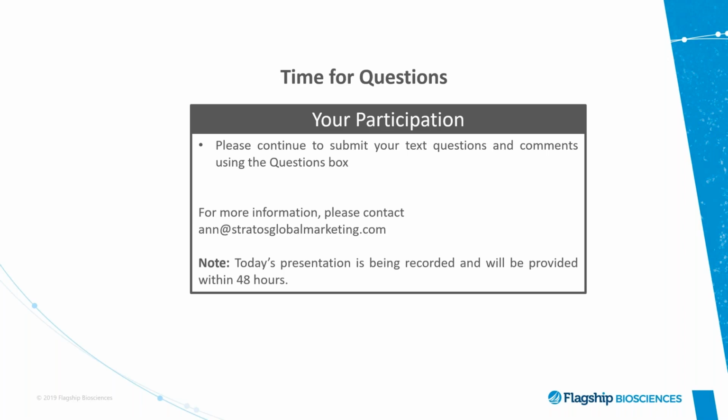Thank you. Another question came up. Does this work for all the PD1, PDL1 assays? And have we had a chance to compare them? Yeah, this actually does work for any PD1, PDL1 assay that has a defined scoring paradigm associated with it. Or for that matter, one could create even his own scoring paradigm.